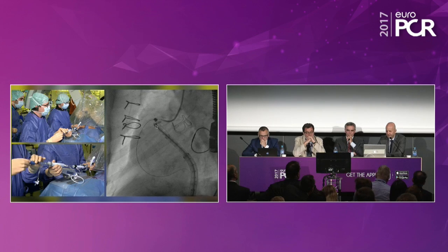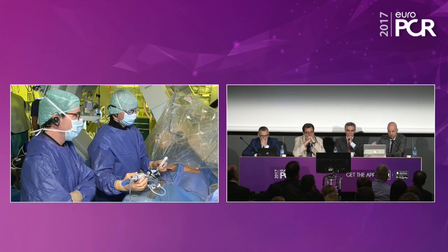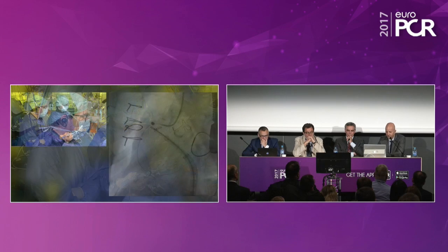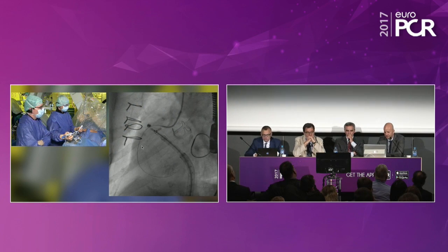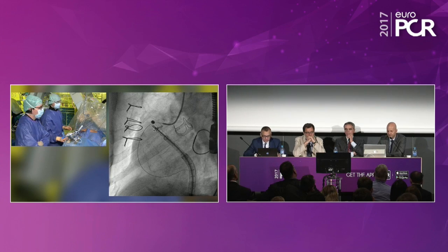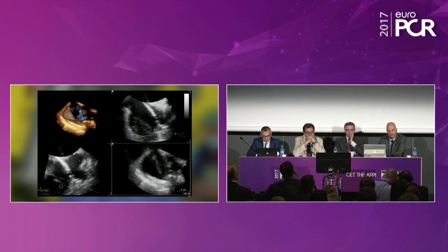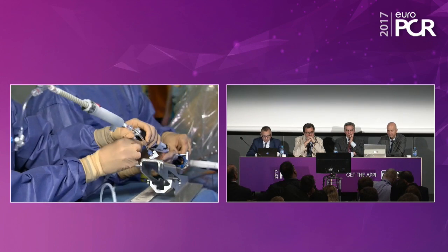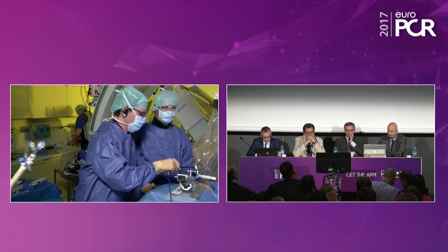And then you implant, as I said, the first 3 anchors really close to each other to have a lot of tension, to have a lot of force on the tissue. And then you just negotiate around step by step. There's an 8 millimeter distance between the anchors. We have different anchor lengths available, 5 and 8 millimeters, and sometimes you are too close to the right coronary artery. Now all anchors are placed.